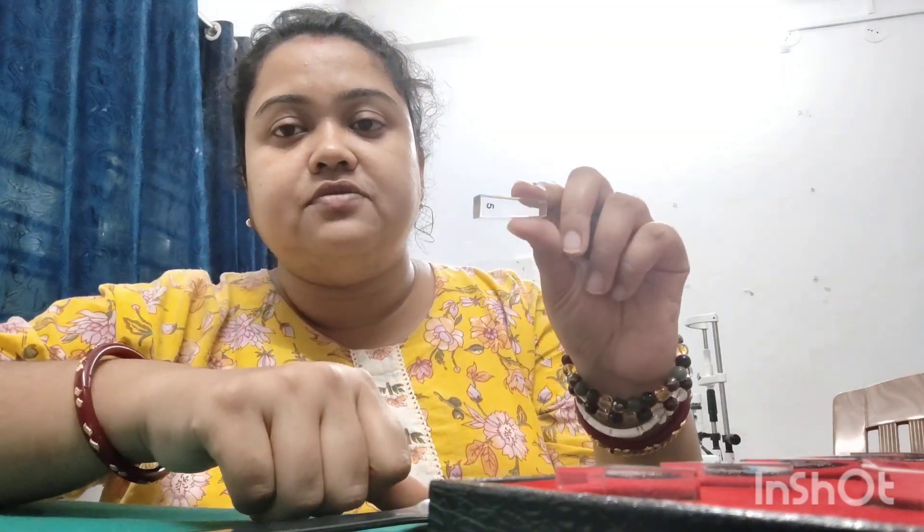Based on the type of squint, you measure the deviation. If the patient has exotropia, start with the 5 prism placed base-in in front of the patient's eye, because for exo we neutralize with base-in prisms. Perform an alternate cover test. Give the patient a near target at 40 centimeters, aligned straight between the nose. The patient fixes the target and you perform the alternate cover test to see whether there is exo deviation. This prism set is used to measure only manifest squint, so start with the lowest prism — 5 prism, base-in.